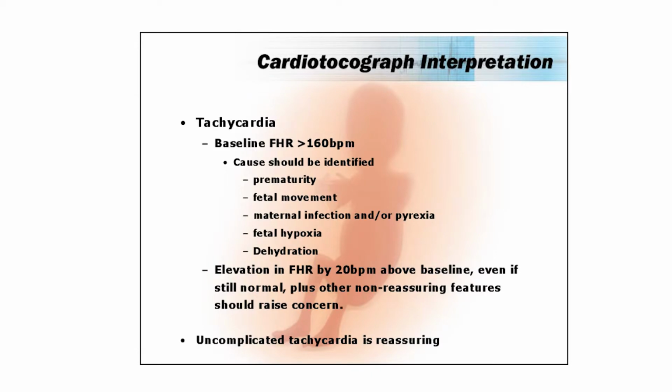What's the cause of the tachycardia? Try and investigate it. Is it maternal pyrexia? Is it maternal infection, chorioamnionitis, for example? Is it prematurity? Common cause of tachycardia. And if you've got a premature infant and you've got a tachycardia, you now have a physiological explanation for the tachycardia.